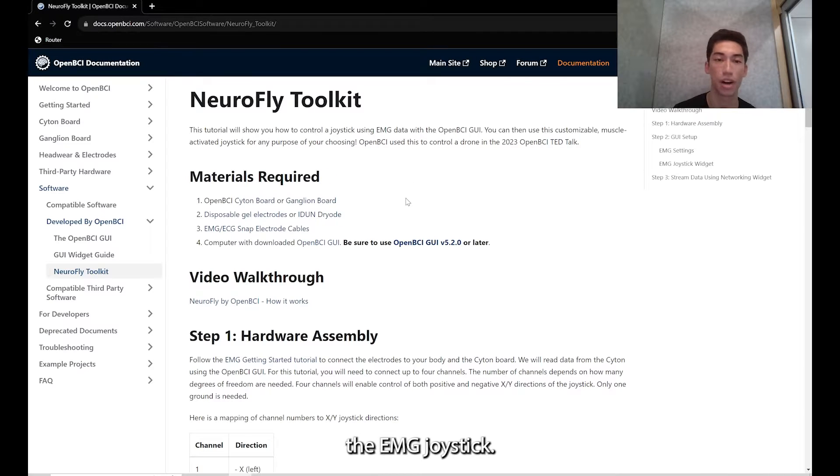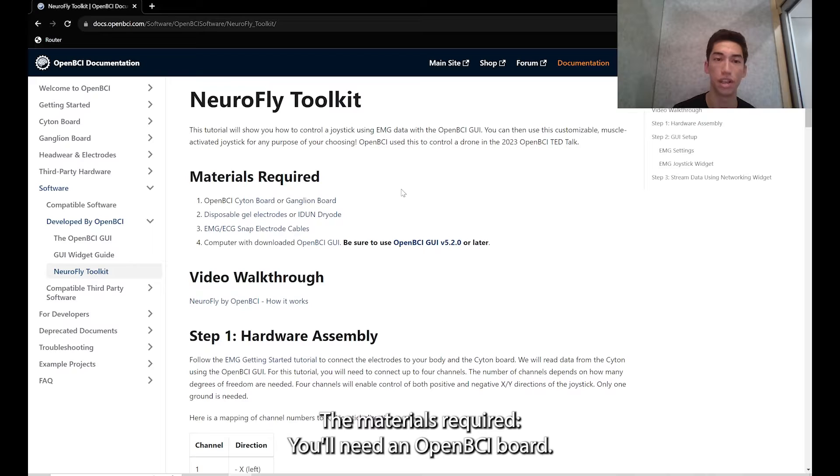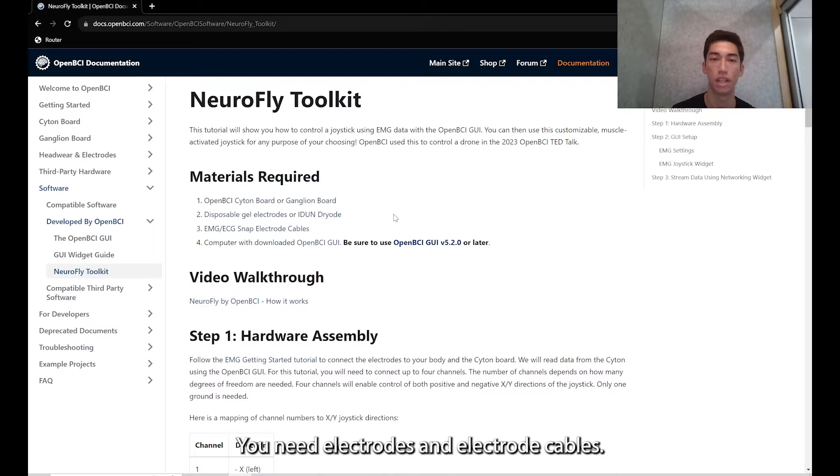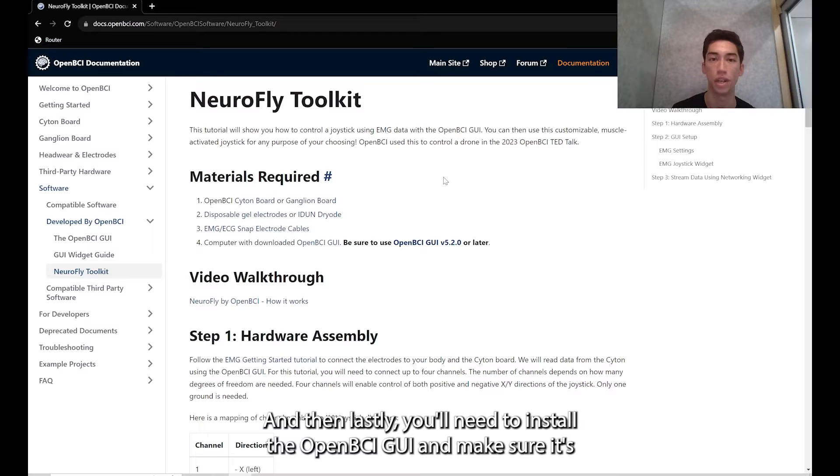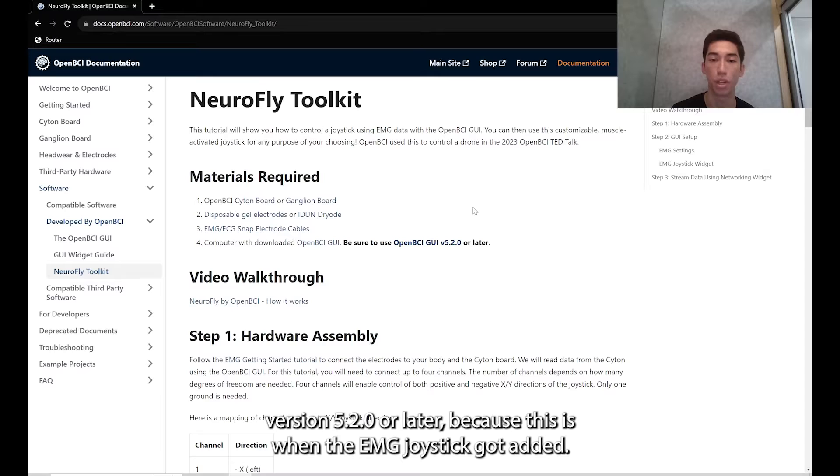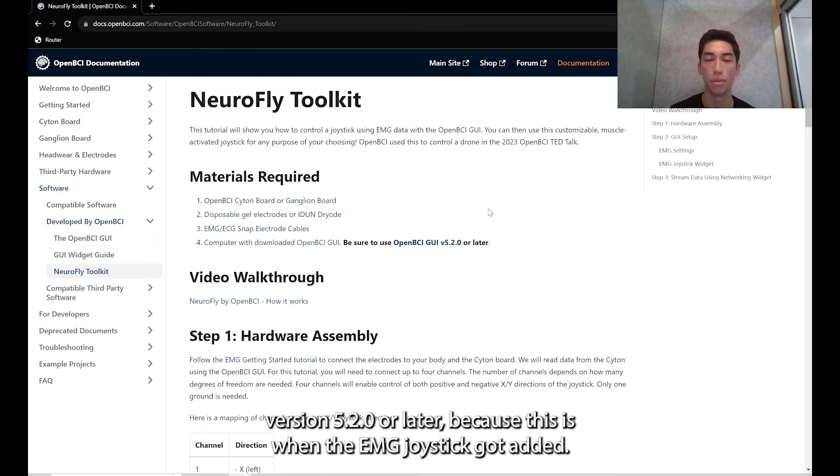The materials required: you'll need an OpenBCI board, electrodes and electrode cables, and you'll need to install the OpenBCI GUI and make sure it's version 5.2.0 or later because this is when the EMG joystick got added.